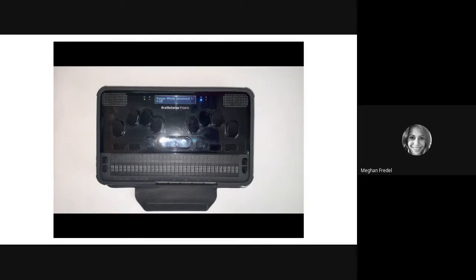To select, you're going to press enter, but say you did want to only check one word, you would use your scroll keys. Paragraph combo box. And arrow down until you find your choice, and then press enter. From cursor to bottom combo box. Current word combo box. Whole document combo box. So we're going to check the whole document, and I'm going to hit enter. Searching live.